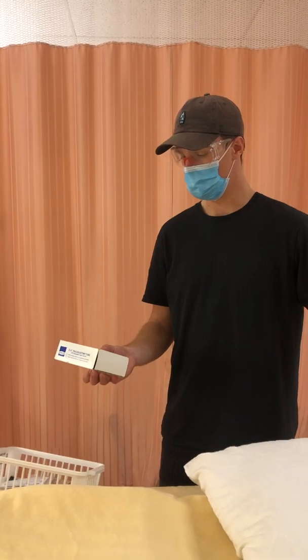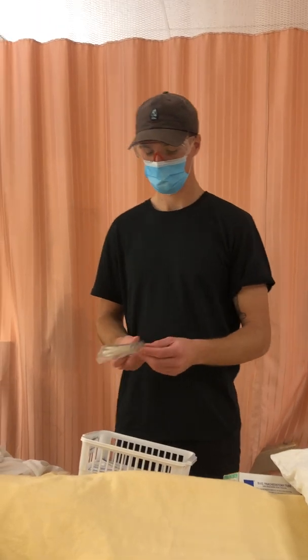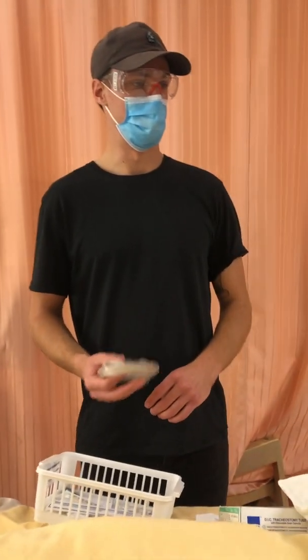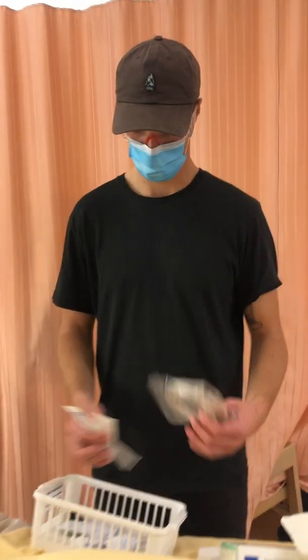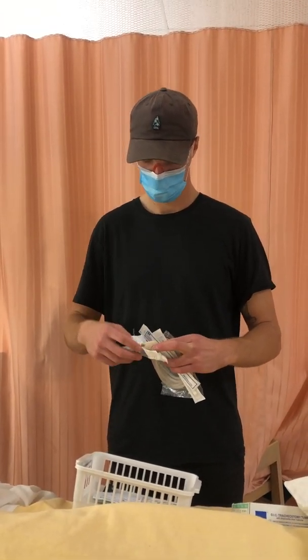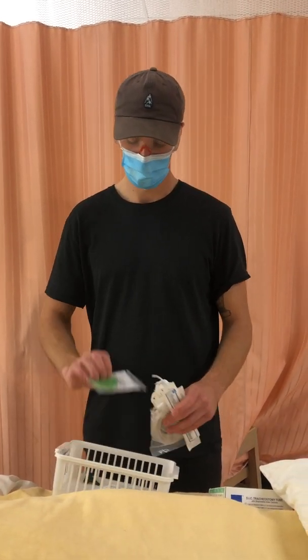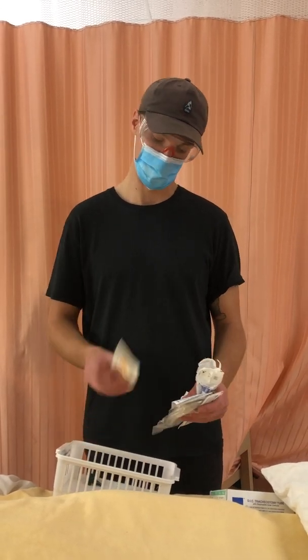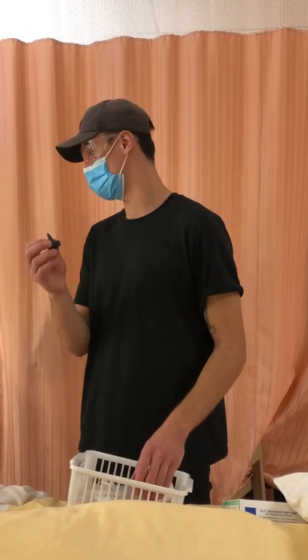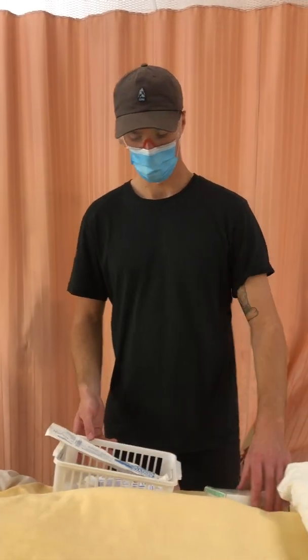This is a new tracheostomy tube if needed, and this is an oxygen supply tube if I was going to use the ambu bag, which I'm not. What else do I have? Some cotton swabs, and some Velcro straps if we're changing the trach, which we're not. And then I have another manometer here. Another cannula, but this isn't the right size, so I won't be using this. And then a Christmas tree, again, for if I was using the ambu bag, which I'm not.